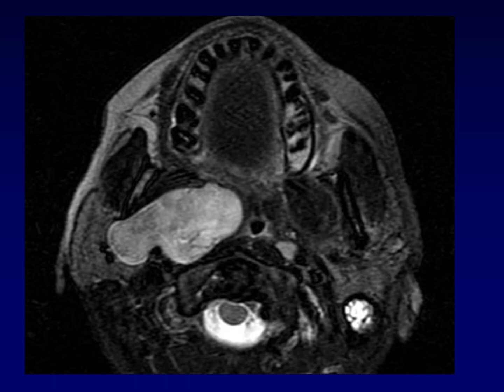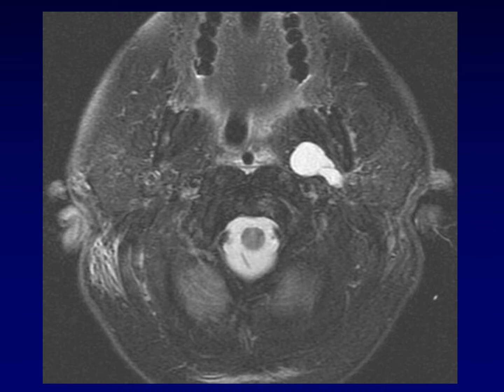Here's another example of a pleomorphic adenoma extending through the stylomandibular tunnel — that's pretty characteristic of a pleomorphic adenoma. When you see a mass in the deep lobe extending through the stylomandibular tunnel, it's even more likely to be a pleomorphic adenoma. Although this tumor is bright, it's not brighter than CSF. Here's another mass arising within the deep lobe, also knuckling out through the stylomandibular tunnel. What clinches it is the T2 signal even brighter than CSF, which is a very specific sign for pleomorphic adenoma.